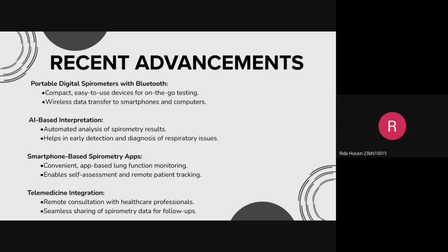Now, recent advancements: portable digital spirometers with Bluetooth. They are compact, easy to use devices for on the go testing. They have wireless data transfer to smartphones and computers. AI based interpretation provides automated analysis of spirometry results. It helps in early detection and diagnosis of respiratory issues.